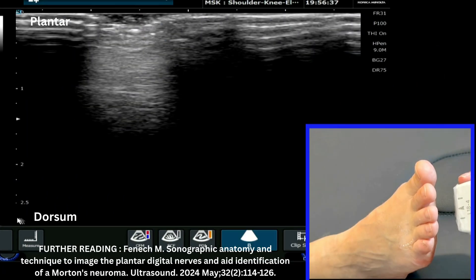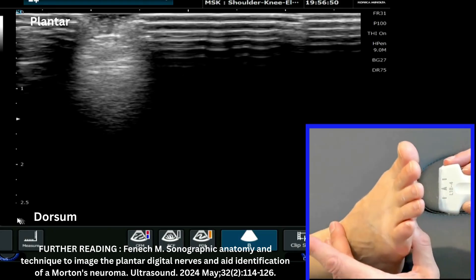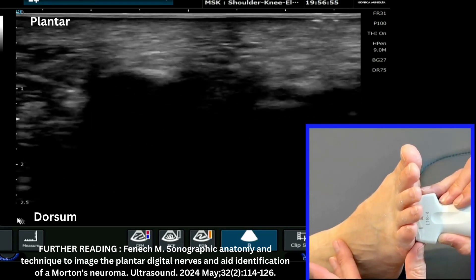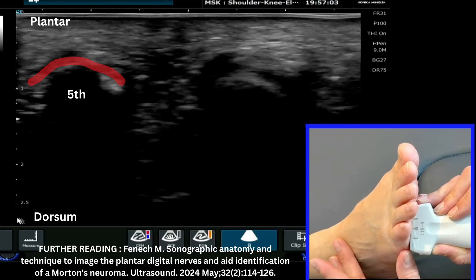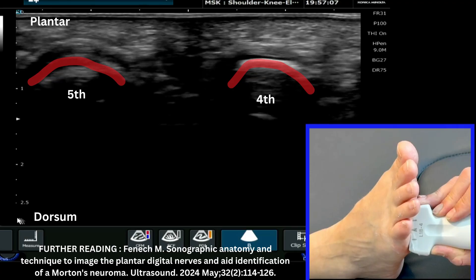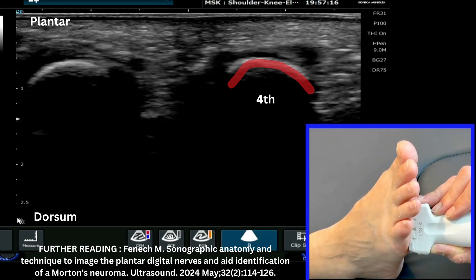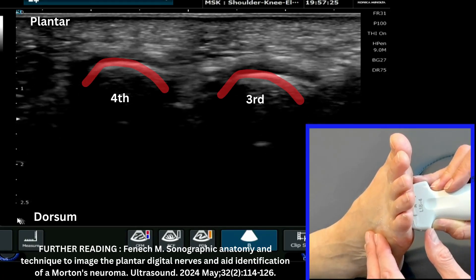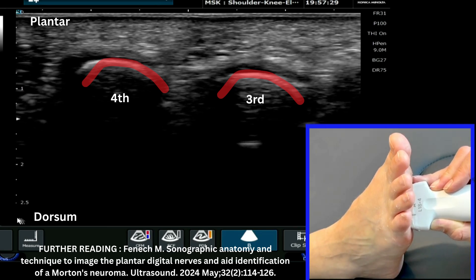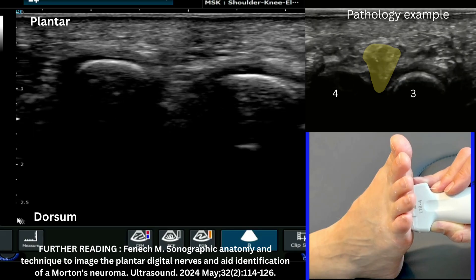We're now going to look at a plantar view of the third-fourth webspace. The patient is sitting with the foot fairly relaxed — you don't want the foot tented up because you need to maneuver the probe. The first key thing is to ensure you're on the correct webspace. My advice is to start right over on the fifth metatarsal — you'll see a clear dome shape on screen — then count across: fifth, fourth, third, and the gap between is the third-fourth webspace. Note the orientation has changed: the top of the image is now the plantar aspect of the foot.